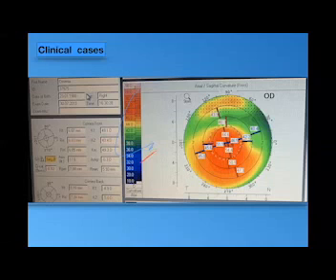Yes, Dr. Hossam is here. I am in the center of this cornea. The superior part of the cornea is 43.9. The next point is 40.3. The next point is 44.6. Crossing the center going to the inferior part, you will find the same point at the same circle is 54.4, right?